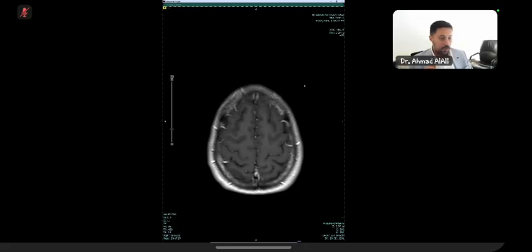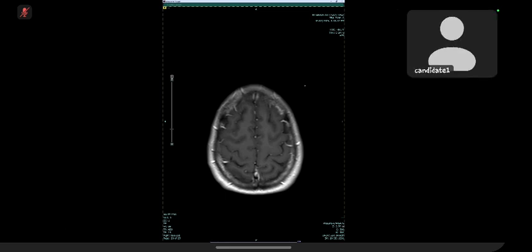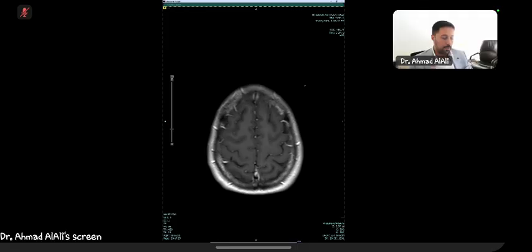Any tip from the patient's clinical data or history could help you to confirm or exclude one of your differentials here? There is some tingling, some sensory symptoms were there, only the ones that I told you already.